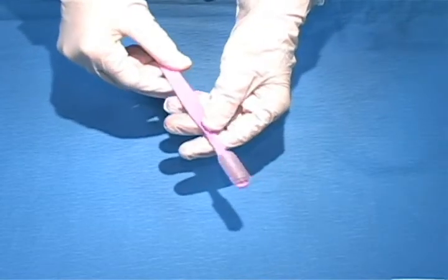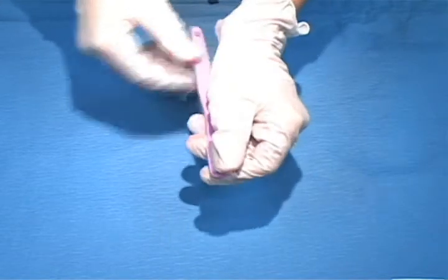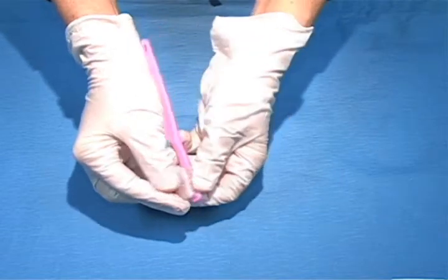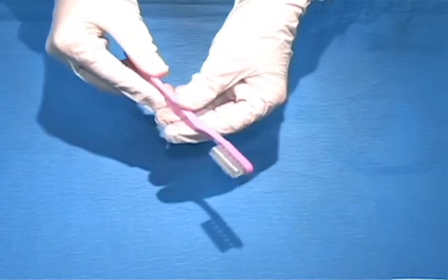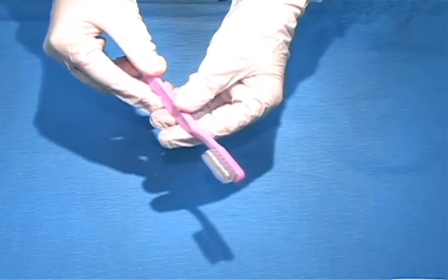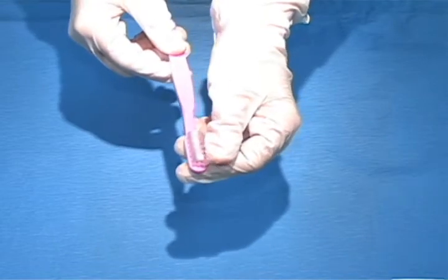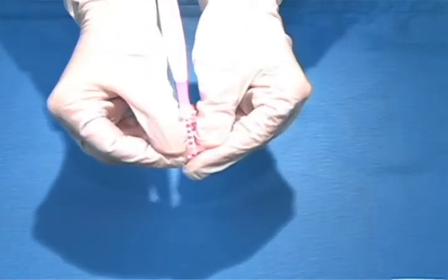The time-saving Collis Curve toothbrush is designed to clean three sides of the teeth at once — the outside, the inside, and the chewing surfaces all at once. It comes in a children's, adult, youth, and perio size in soft or medium. We like to use the soft bristles because they're gentle on gums, and the perio size because the bristles are long enough to reach the gum line.